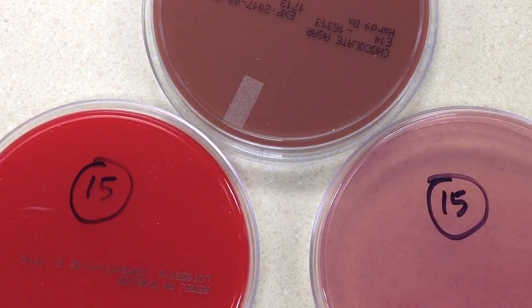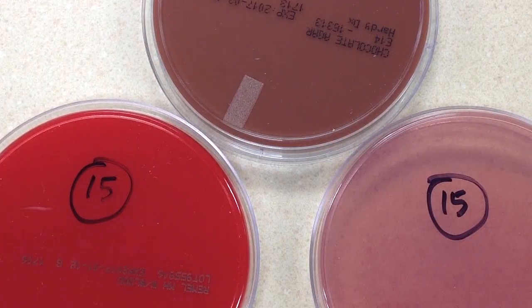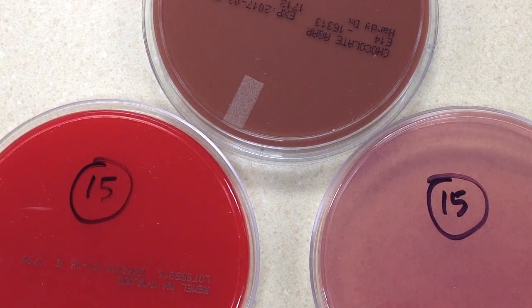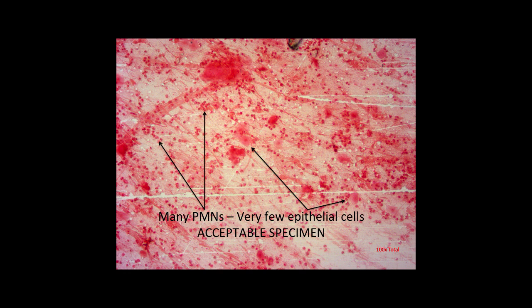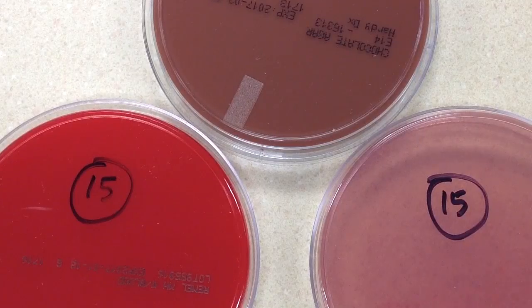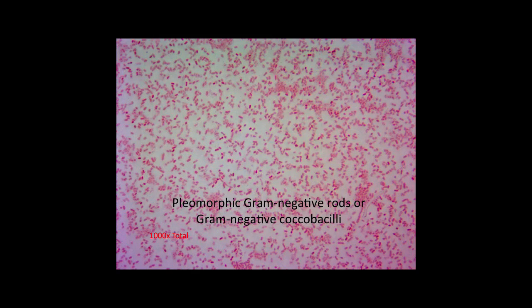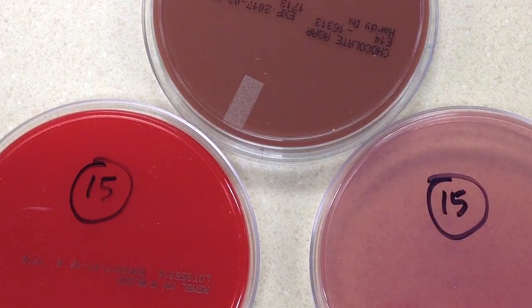Here is another sputum specimen. This time we have a 32-year-old male who is suffering from pneumonia. When we went ahead and did the gram stain or direct smear from the specimen, it was an acceptable specimen — meaning there were plenty of PMNs and very few epithelial cells. There were also exclusively pleomorphic gram-negative rods, and pleomorphic means of different shapes and sizes.